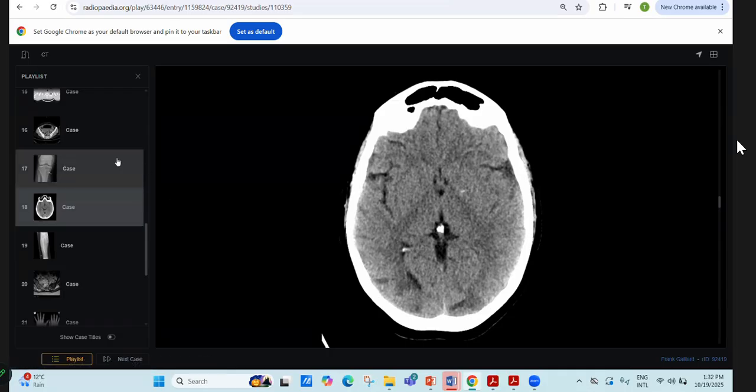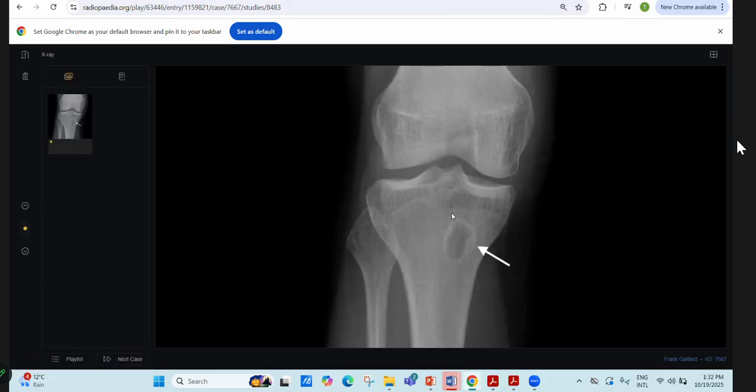So it is PRES, and then it is the Brodie's abscess. It was straightforward. They could ask MRI features of Brodie's abscess, especially what is the penumbra sign. I'm not remembering it fully, but I remember the question. It is a very important question from the exam point of view. Just go on Radiopaedia and check afterwards. On the T1 weighted image there is some enhancement, and that is why it is called penumbra. Please have a look at it.